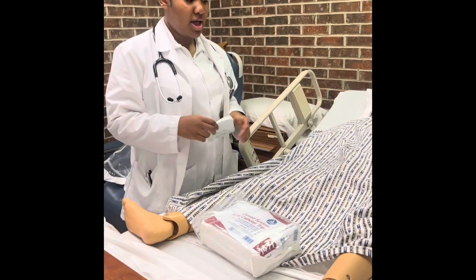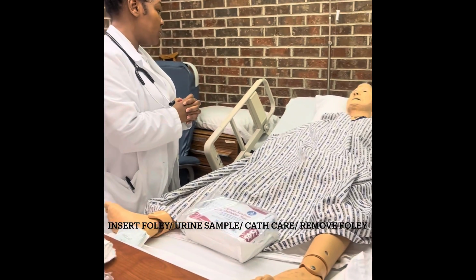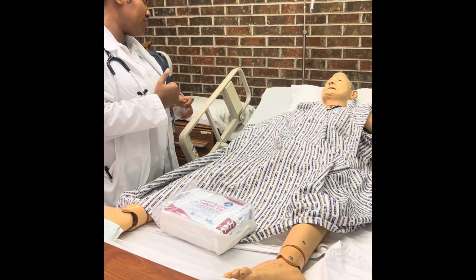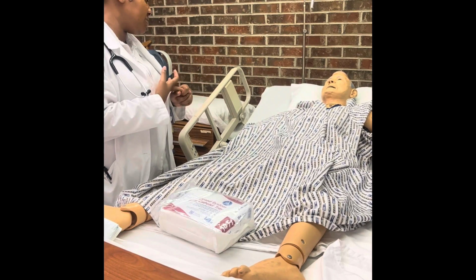Thank you. All right, hi. So right now I'm going to be putting in, well, hi, Mr. Smith. My name is Jacquette Gillum. Right now I'm going to be putting in a foley cath for you. I'm going to be taking the urine sample, doing some routine catheter tube care, and then discontinuing it.